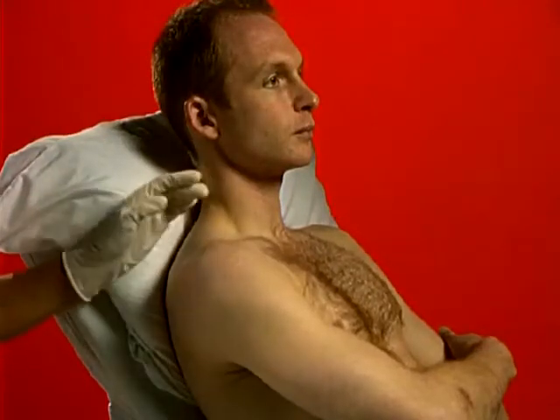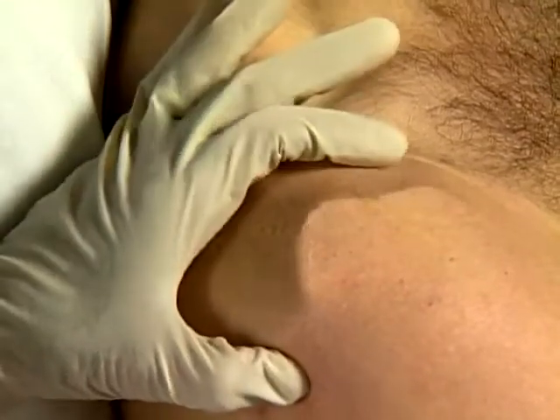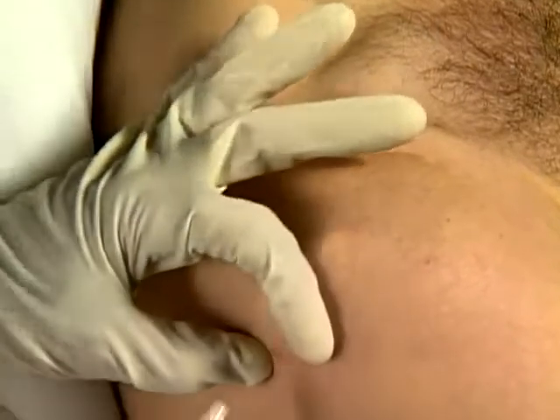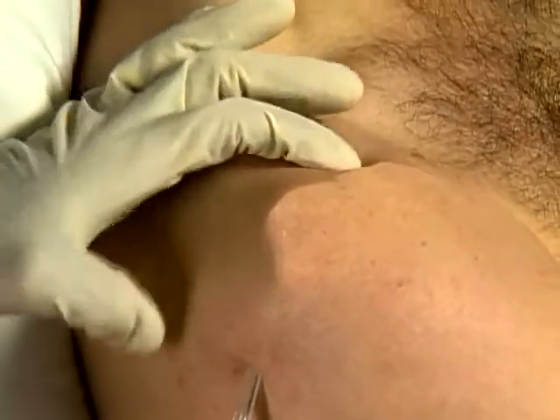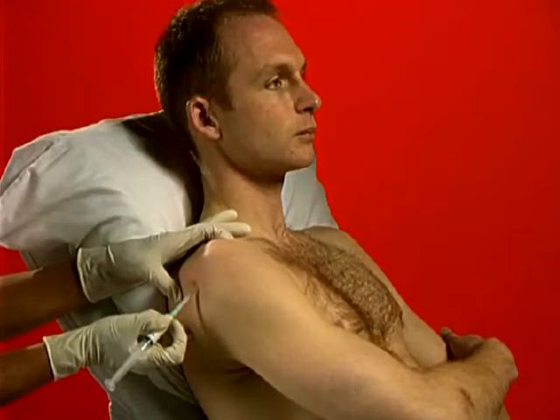Identify the posterior angle of the acromion and the coracoid process anteriorly. Mark entry point immediately below the posterior angle. Clean and firmly stretch skin. Rapidly insert needle perpendicularly. Angle slowly anteriorly towards coracoid. Aspirate and inject as a bolus.